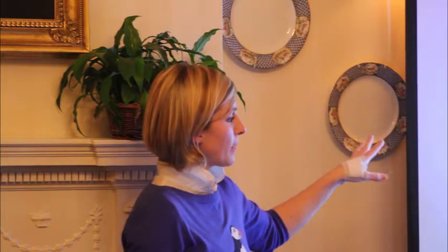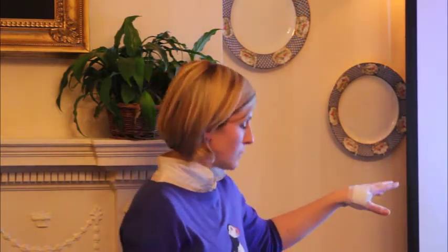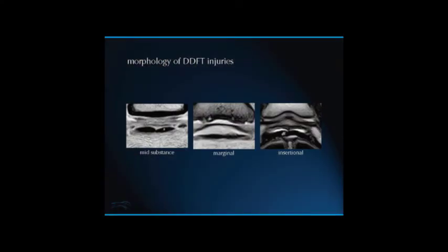Looking at injuries more specifically, this is a mid-substance injury here — classically what we would call a core lesion. Importantly, the margins of the tendon are intact. Compare that to this injury here. These are very nasty injuries. When we have that sort of prolapse of tendon fibres within the navicular bursa — this is the navicular bursa here, that's fluid in the navicular bursa — these injuries cause a lot of inflammation in the bursa. They are secreting matrix proteins that are causing inflammation. Whenever you leave that fibrillated tendon with prolapsed fibres, you get this ongoing persistent bursa inflammation, which can be very, very painful.